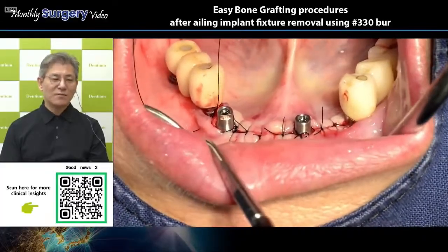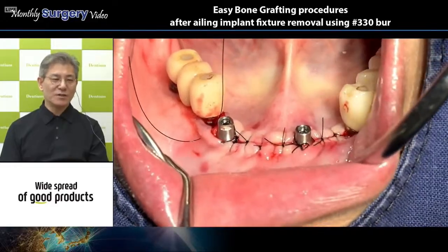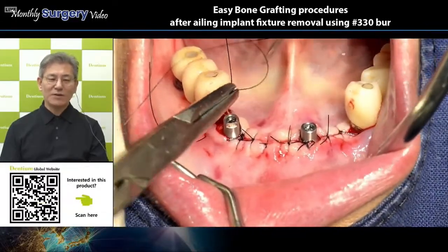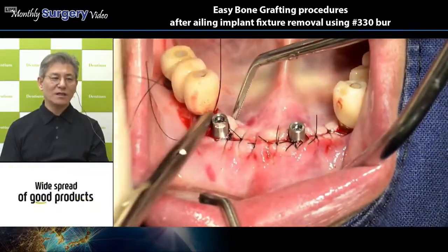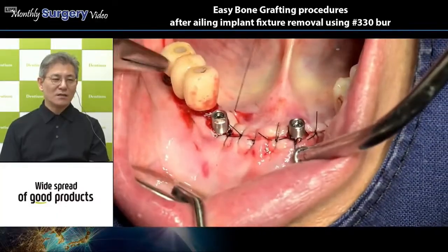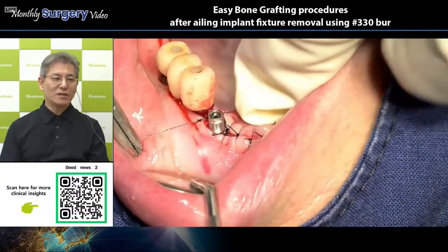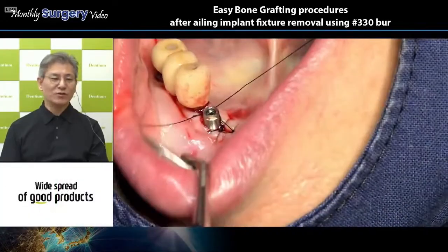A good implant system like the Bright TL makes implant surgery simpler than before, and it no longer needs the big periosteal releasing incision. Because of the open healing technique, this collagen graft, a brand new regeneration material, is available for use.